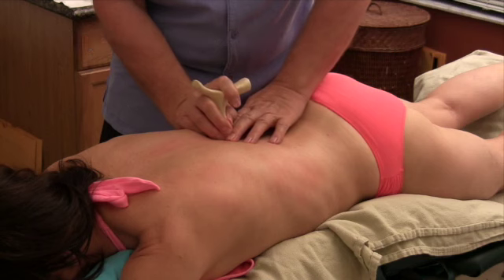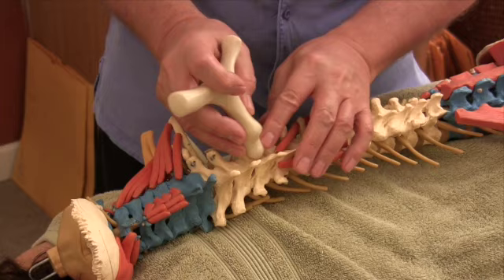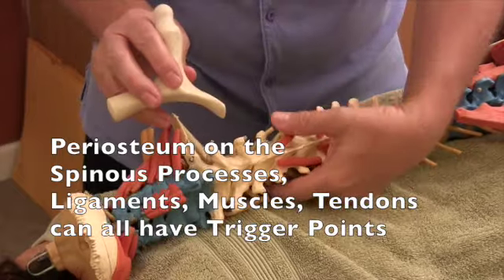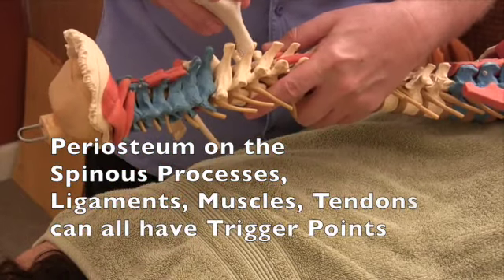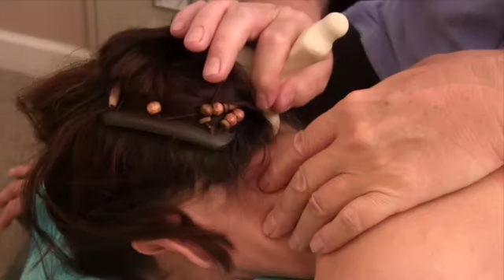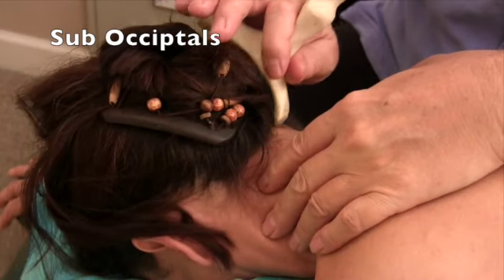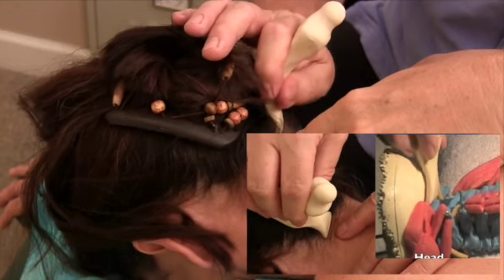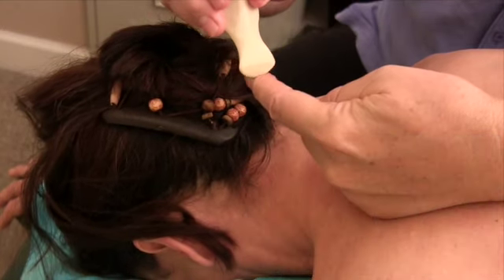Right there I feel a little speed bump. So you can work through there. Then you can take the little tool and work right in between the spinous processes. I can go right in between. Because of the shape of the tool, it will just lift up and over and not catch.